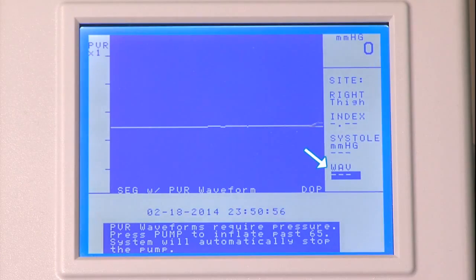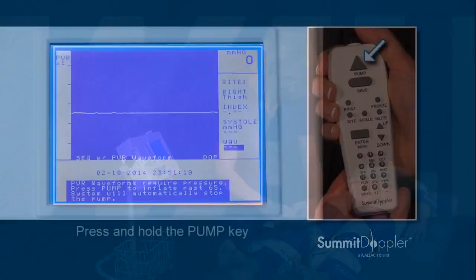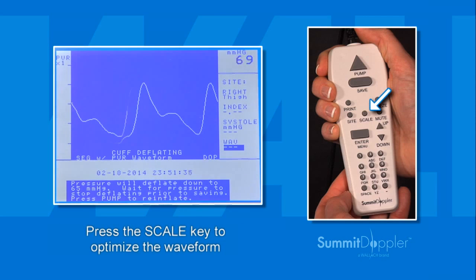The display will prompt you to move to the right thigh site. Connect the hose to the cuff at this site. Once connected, to obtain the right thigh waveform, press and hold the pump key on the keypad until the cuff reaches 75 mmHg. It will stop automatically and deflate to 65 mmHg in order to capture the optimum PVR waveform on the display. If needed, press the scale key to optimize the waveform if it does not fit the screen correctly.